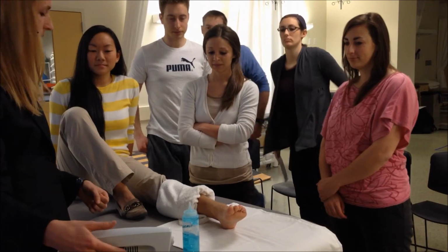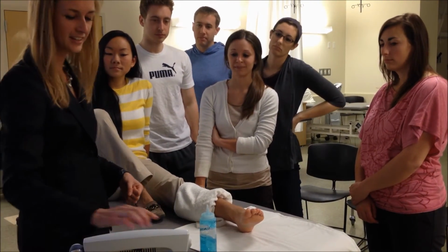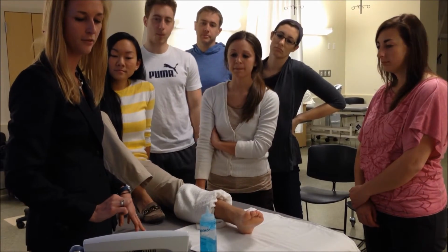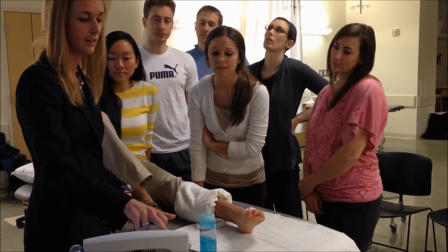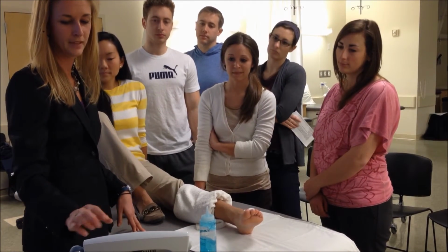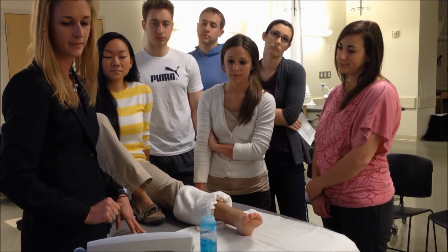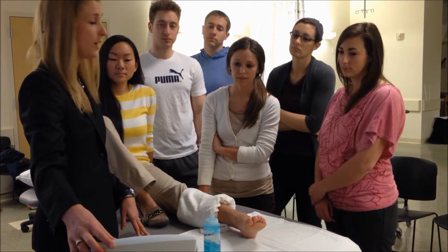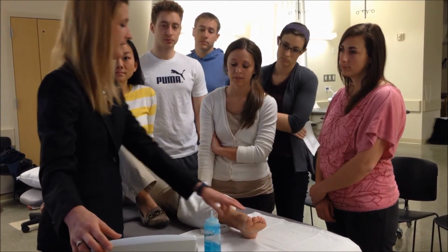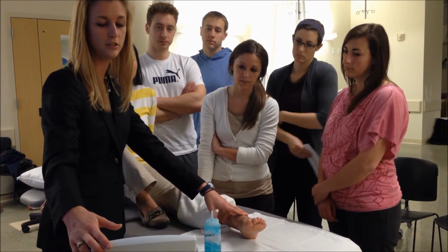All right, to turn this baby on, the power button's back here. And then it'll give you a list of different features. We're going to click on ultrasound. Okay, so edit right here. We want to edit the parameters. Push this button. Frequency right now is at 1 megahertz. We want to change that. The anterior talofibular ligament is pretty superficial, so we're going to change that to 3.